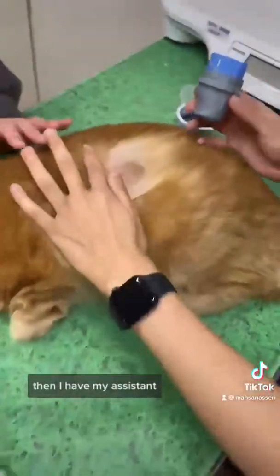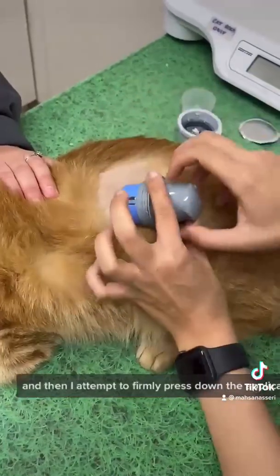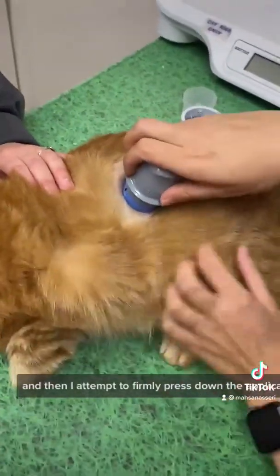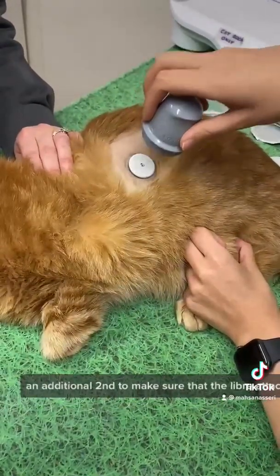Then I have my assistant hold Cheeto down, and then I firmly press down the applicator and hold for an additional second to make sure that the Libre attaches.